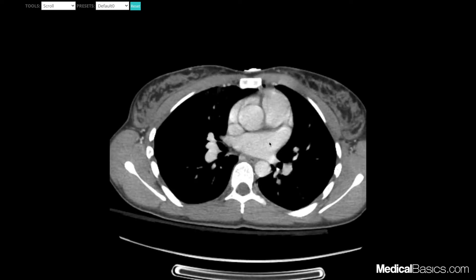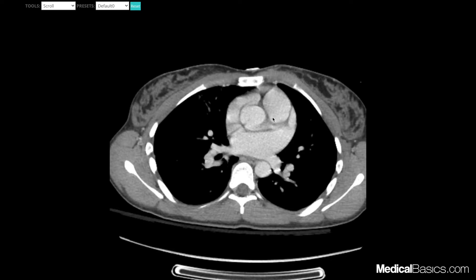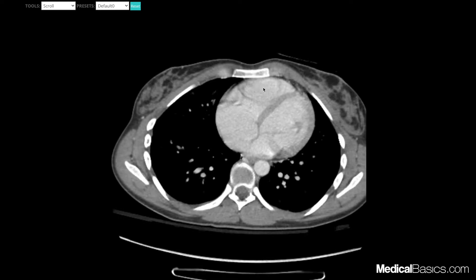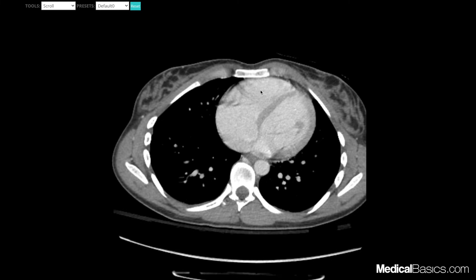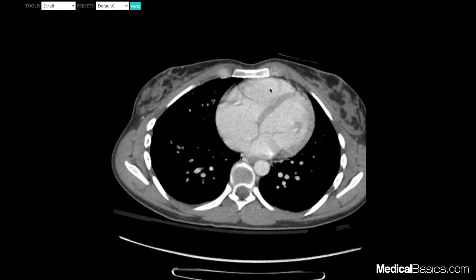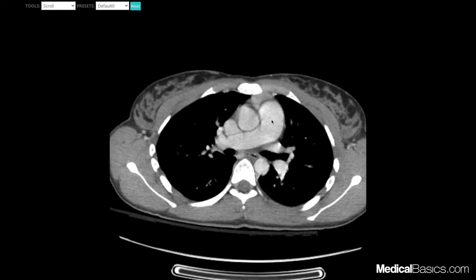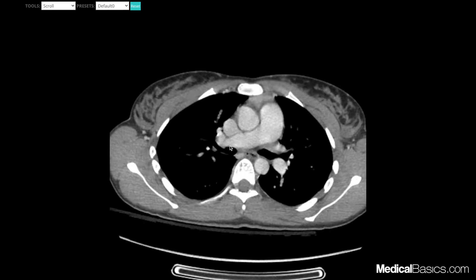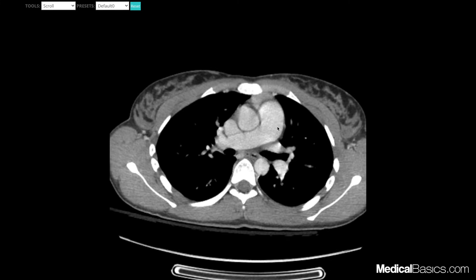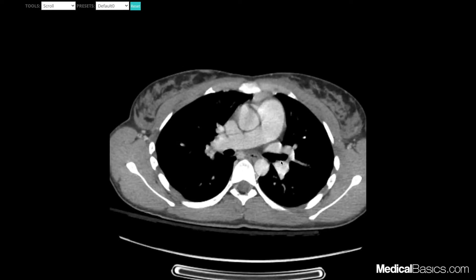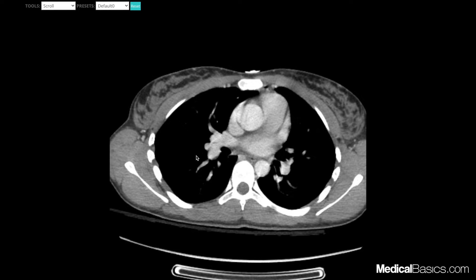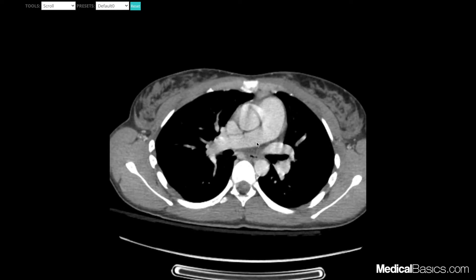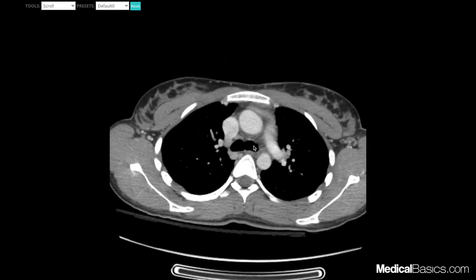In addition, coming off of the right ventricle we're going to have our main pulmonary artery, which branches into our right and left pulmonary arteries. There are many different branches that I'll go over in another video when I talk about pulmonary embolisms.